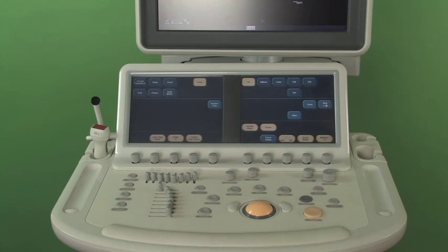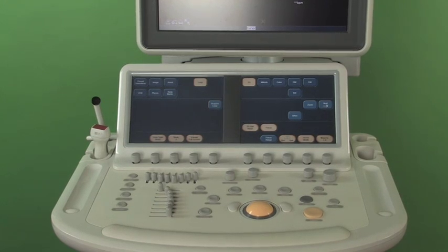And now we're live scanning, and it'll also automatically change the presets back to our normal preset that we were using for adult cardiac.